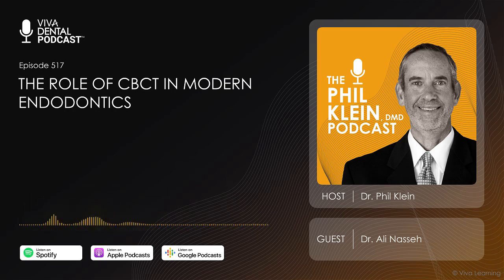Yeah. Can I add one quick thing here? Sure. One area where this is really valuable is what you just said, what you find out when you get inside. For example, a lot of times with lower anterior teeth, you take a regular front-facing periapical image, and it looks like a root canal that's done beautifully, but then there is a large lesion at the apex of the tooth.